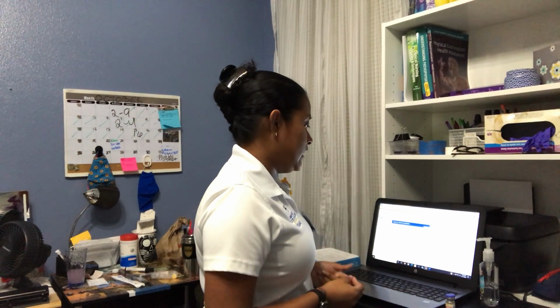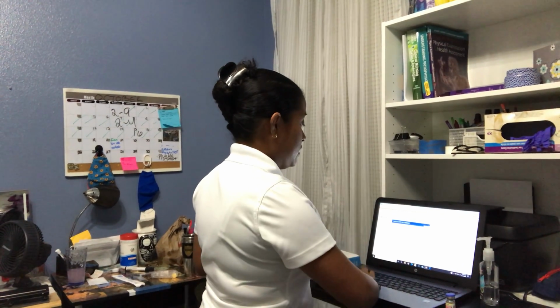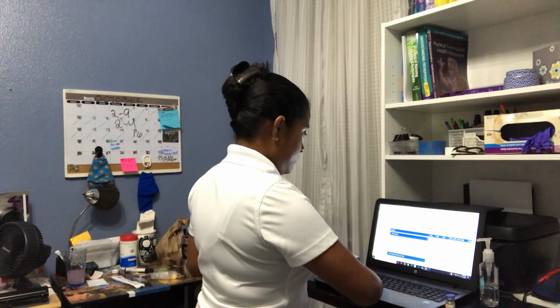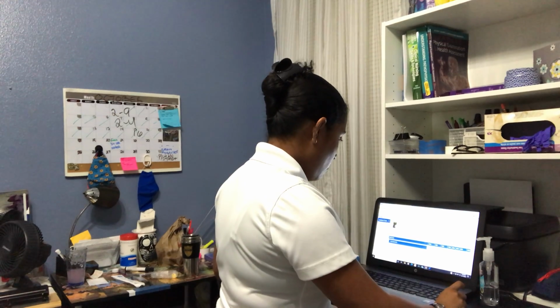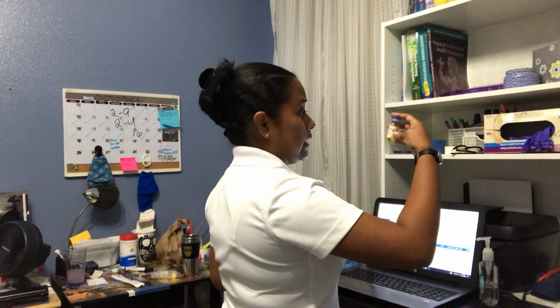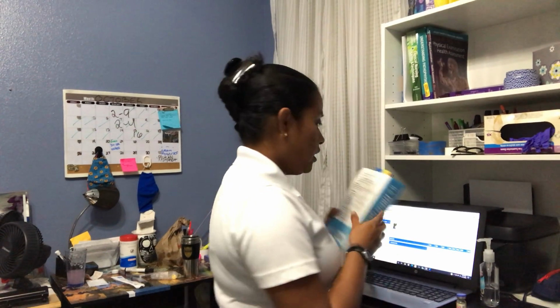And the time, it is 1900, so it's almost time for bed, so it's scheduled for now. Alright. Now that we have that, next, this is a vial. It's a multi-dose vial, so that's what we have here. Next, I have calculated it. It is 4 units we're going to be taking out. Next, it is not expired.